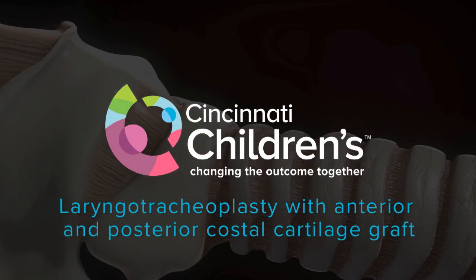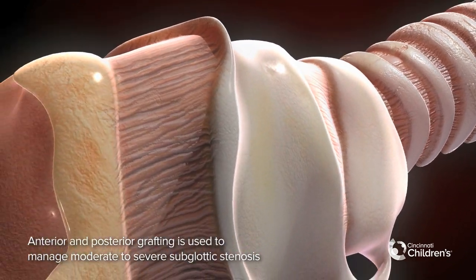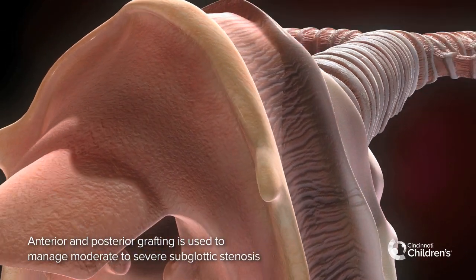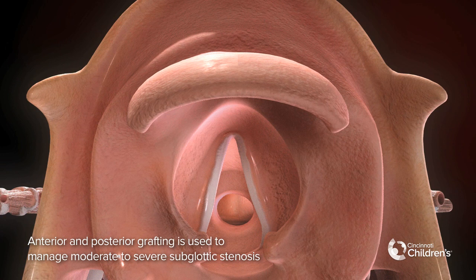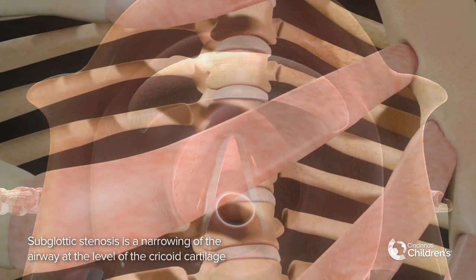Laryngotracheoplasty with anterior and posterior costal cartilage graft. Anterior and posterior grafting is used to manage moderate to severe subglottic stenosis. Subglottic stenosis is a narrowing of the airway at the level of the cricoid cartilage.